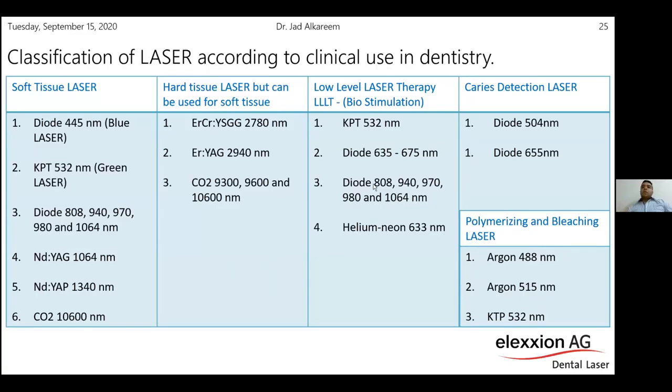So this table can give you a brief differentiation between the different wavelengths that we have in our market.